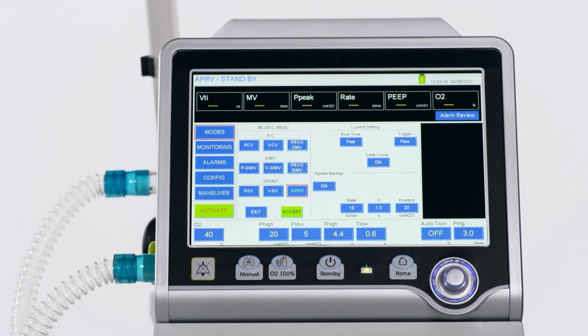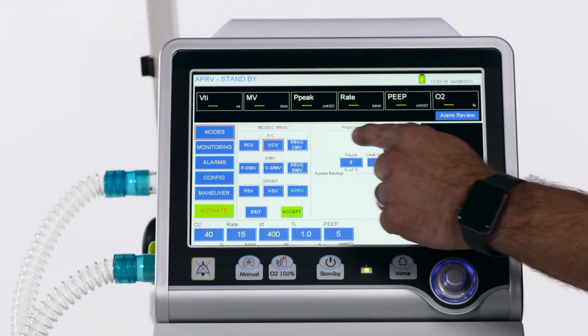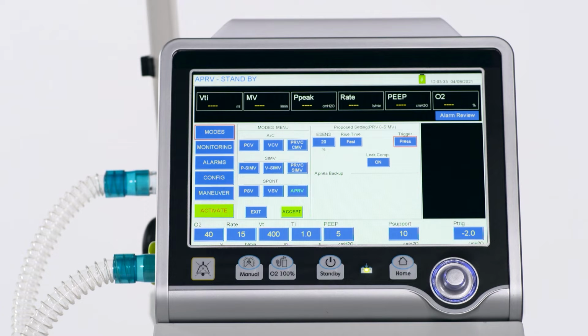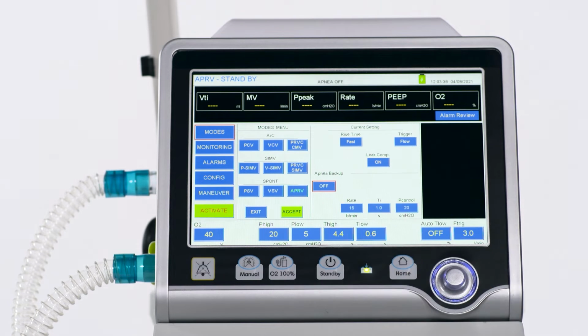After entering the patient data, the system shows the main screen. In the Modes menu, you see the current mode and its parameters. Available ventilation modes are assist control, SIMV volumetric, pressurized, and both of them, and modes such as PSV, VSV, and APRV.